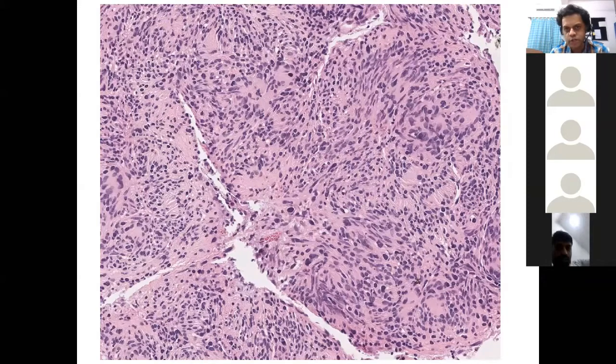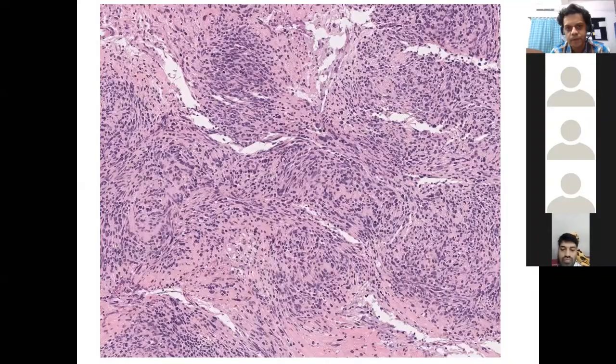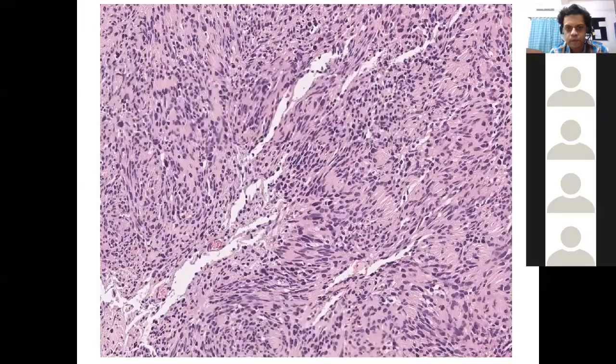And now going into the larger nodules, which are totally blue, we see that obviously the cellularity is very, very high compared to what we have seen before. And even at this power, the atypia is quite appreciable. The cells are pretty much atypical. They are hyperchromatic. There is pleomorphism. Okay, and if you see, there's a bit of verocay body formation also, right? Going from the 6 o'clock position towards the center, one area where there's a slight verocay-like appearance. I felt it's verocay-like. I don't know whether you feel it like that. It looks like a regimented row with some kind of a separation. So it might look like verocay body formation sometimes. It's not a proper verocay body. Okay, here. So here, somewhere towards the top, right?